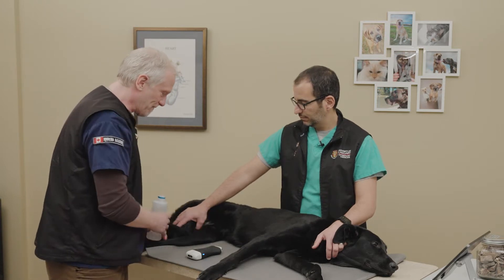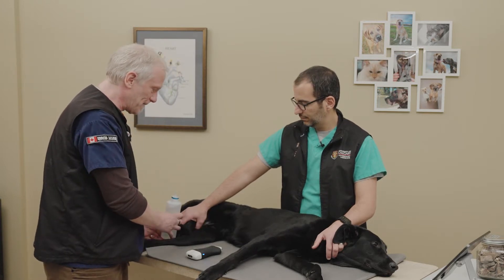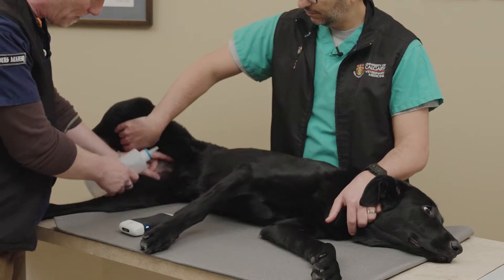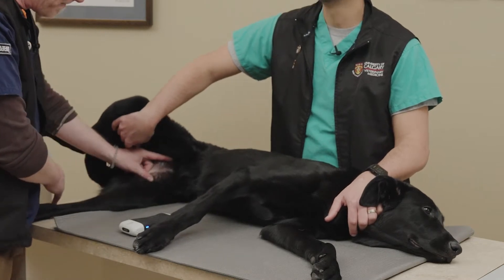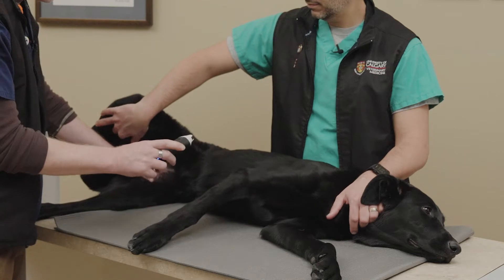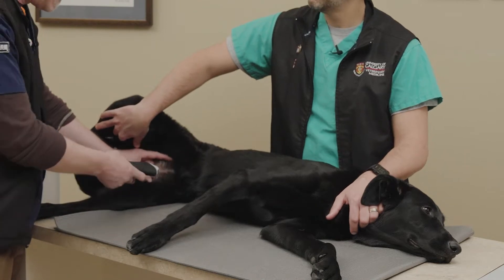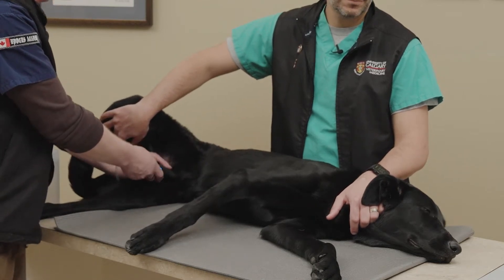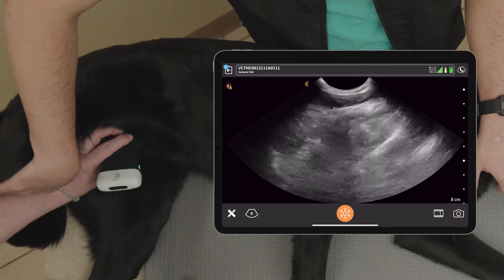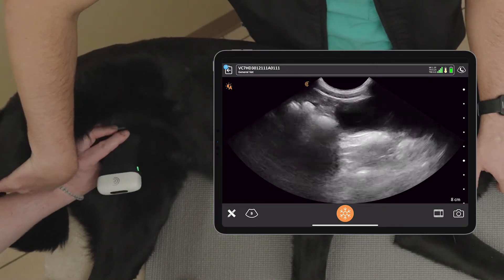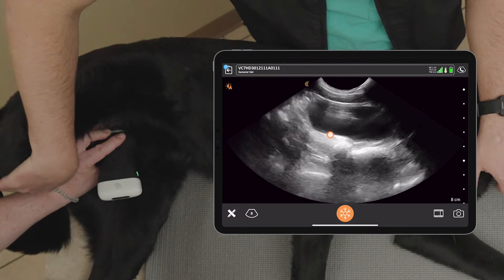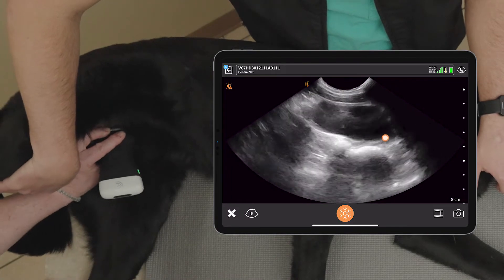So we're going to come back to this region here. We have to lift the leg up a little bit, Dr. Schlup, just so that we can get into that site. Separate the fur so you can see the skin. And then once you've got that vision there, we put the probe marker towards the head to start with. We'll start with our longitudinal image of the urinary bladder. I'm just going to fan back and forth and see if we can pick up that urinary bladder at this pelvic region.